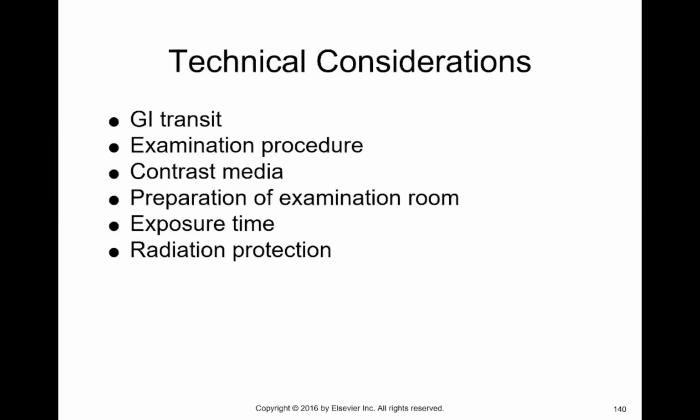And there are clinical signs for that. If you take a scout x-ray on the patient and you see what appears to be free air, especially if you're upright and the patient has free air up under their diaphragm, that's a good indication that they've got a duodenal ulcer. So you certainly would not want to have a patient take barium.